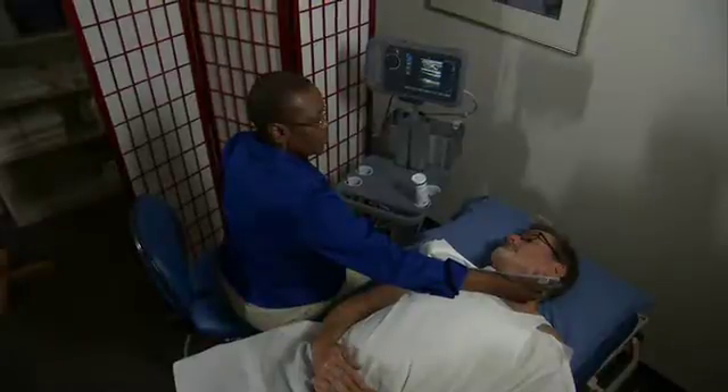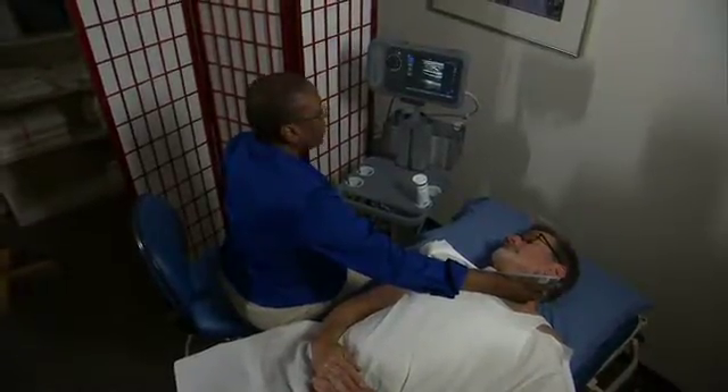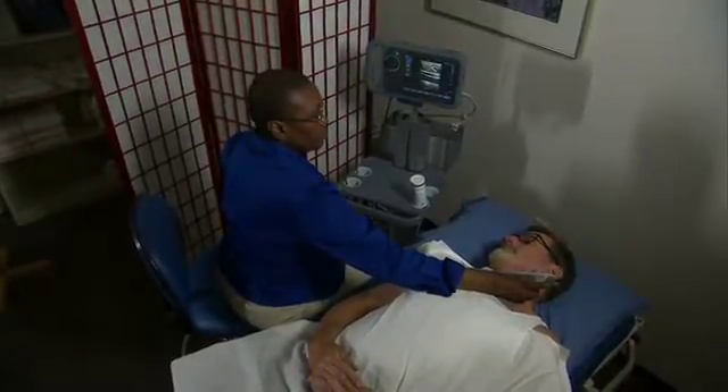Things are getting smaller. They're getting better. The size of this unit looks to me like we can set it on a side table, we can set it on a sink counter, we can balance it on our lap on a stool and get the job done. And that's exciting.